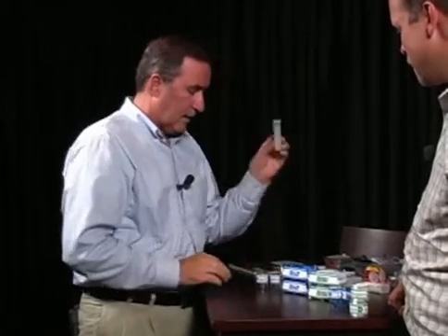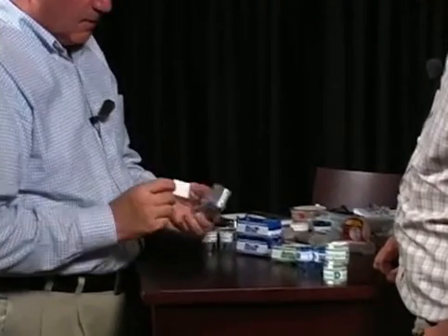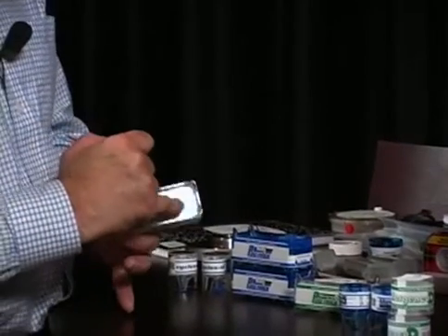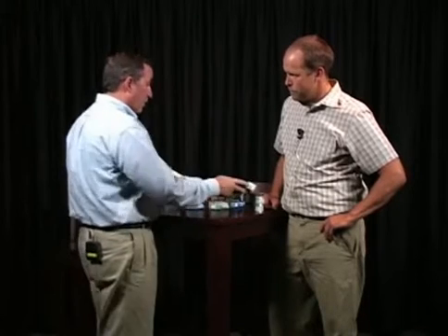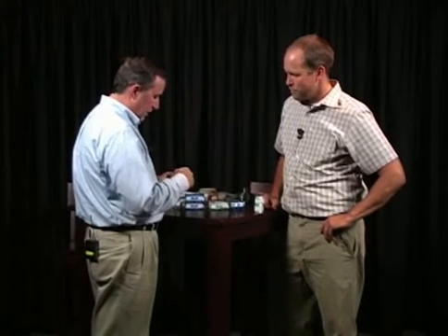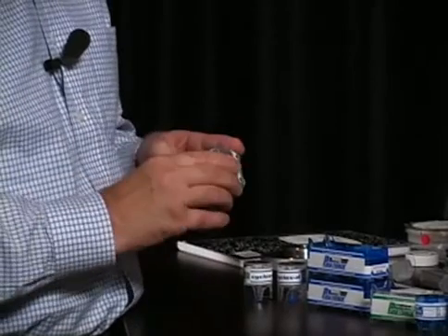There are other kinds of samplers now on the market, and this is a particular one that has been a good innovation. It's again a slit-like sampler, but the innovation is that these slides are barcoded. So each slide is uniquely identified with this sample. It's got a really nice large space to write on. That's right. One of the problems with the round device is that there isn't a place to write, and it's often very obscure by the time the lab gets it, after it's been in pockets and mailed, what the cassette really says. To verify that it's on the chain of custody is often difficult. But here's a nice large area to write on. And what I like, especially, is that unique barcode. And we have found that you can read these barcodes in this box without taking them out.